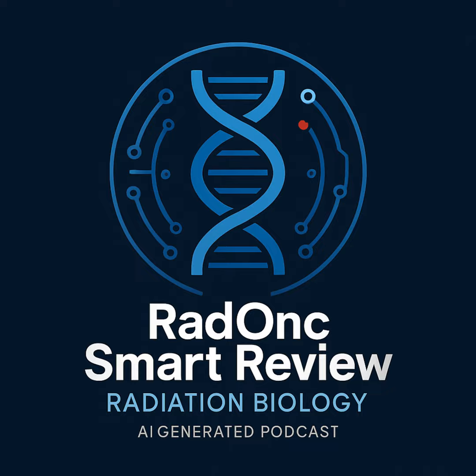Perfect. Pearl number 3, 18F-FDG. It's a glucose analog trapped by hexokinase phosphorylation, measuring glucose metabolism. Think tumor detection, staging, metabolic volume definition for planning, and SUV changes for response assessment. It's the workhorse. Excellent. And pearl number 4, hypoxia tracers like 18F-FMISO and 18F-FAZA.